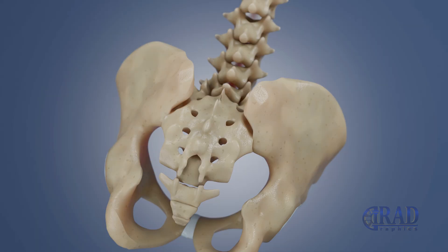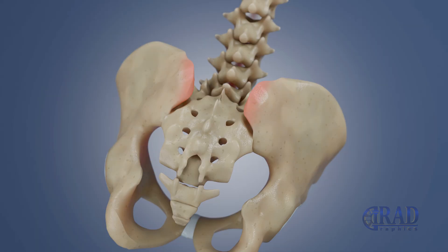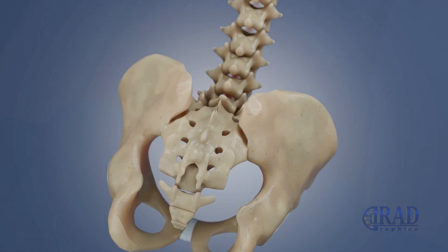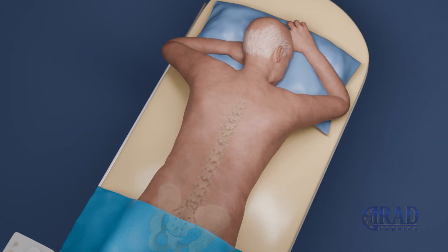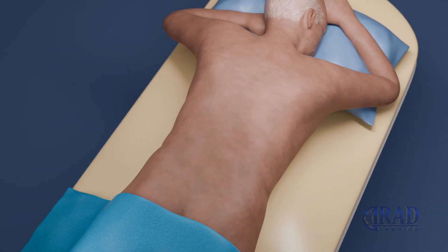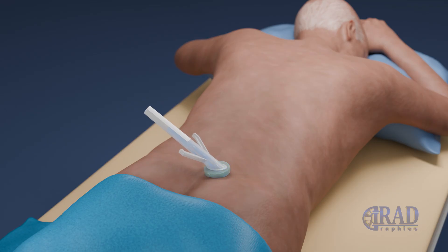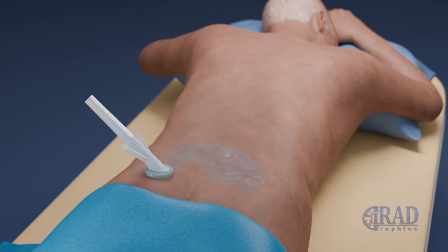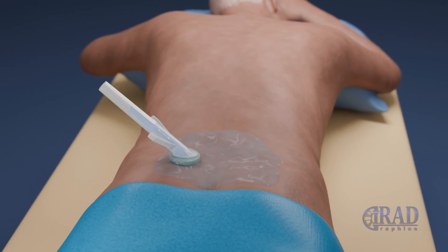The most common site for bone marrow biopsy is the posterior iliac crest. The patient is positioned on the procedure table in the prone position. The skin is sterilized, and a sterile drape is applied to maintain a sterile field.